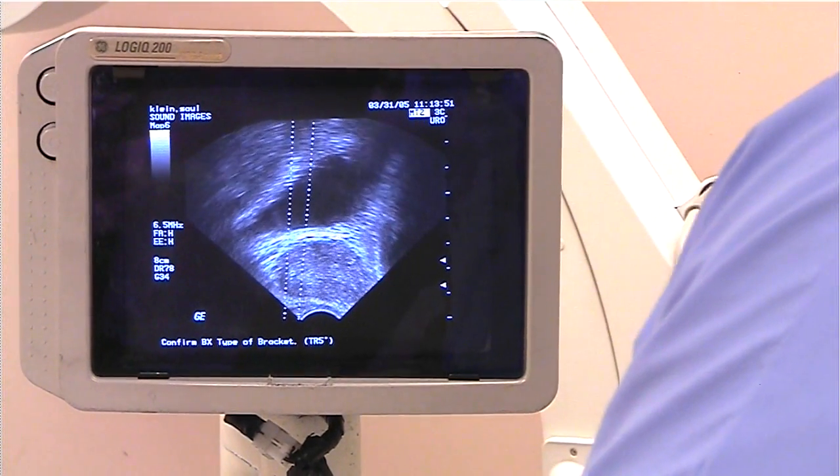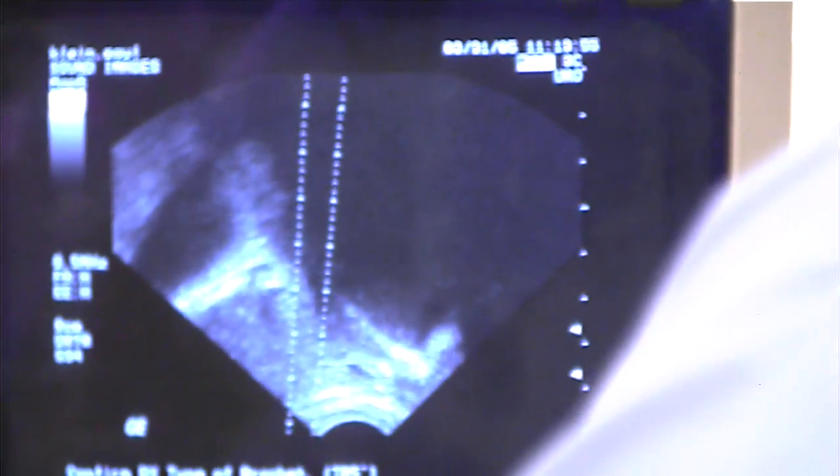Let's go to the apex this time, MJ. We'll scoot over to the right apical portion of the gland. Just a little bit more towards the apex if we can — right there.